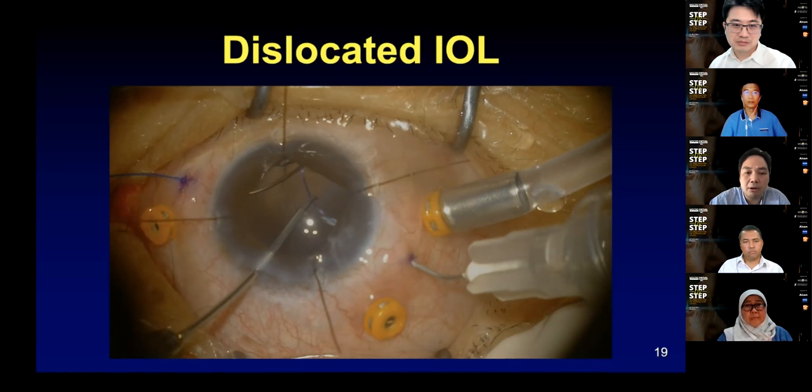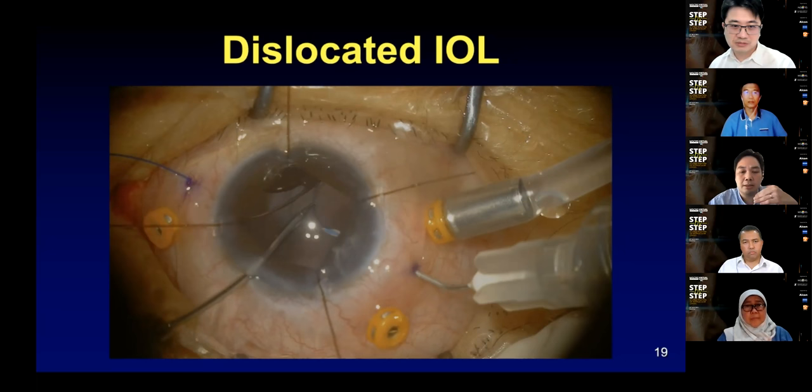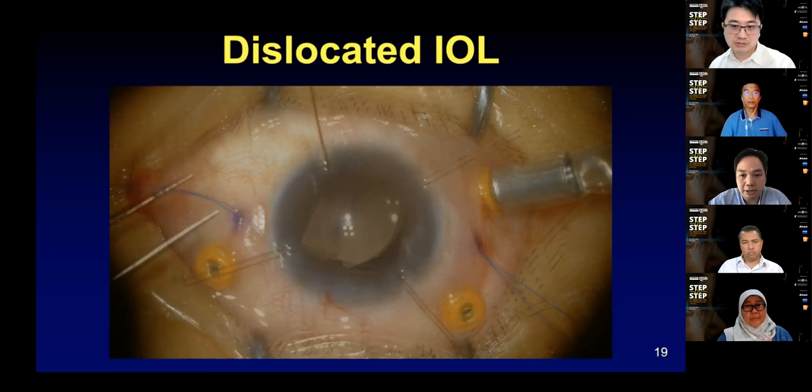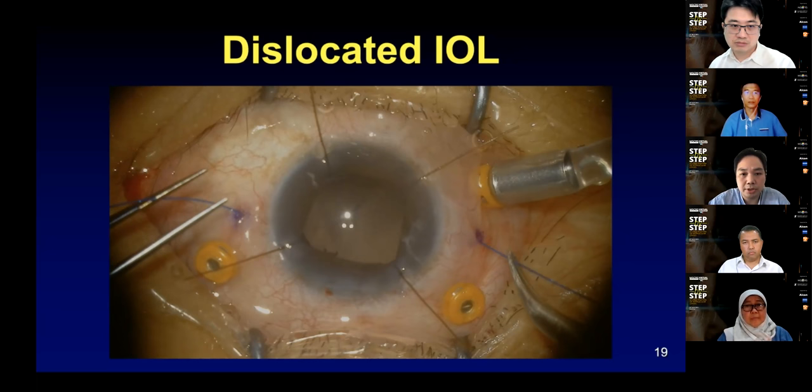You see the IOL is being pushed further into the eye. And what you don't want is to have such a long length of proline suture that the IOL is dangling too near the retina, because you obviously need to have a good vitreous clearance before you do that. So you see now, once you actually tug on both sutures, you get the lens quite nicely centered there.